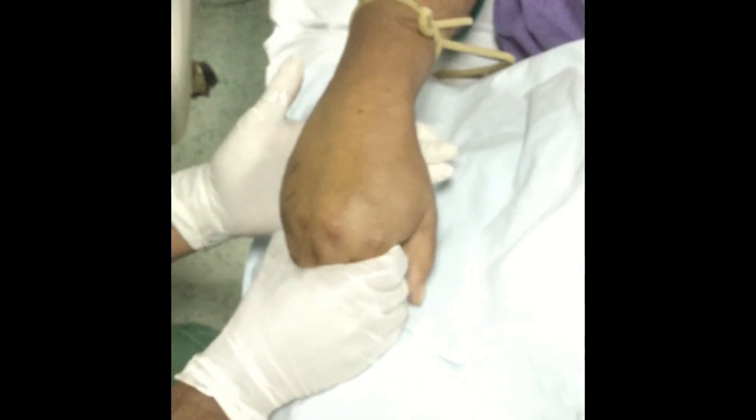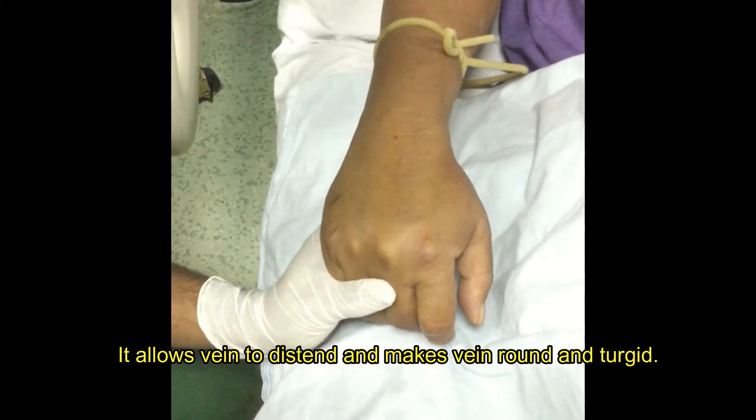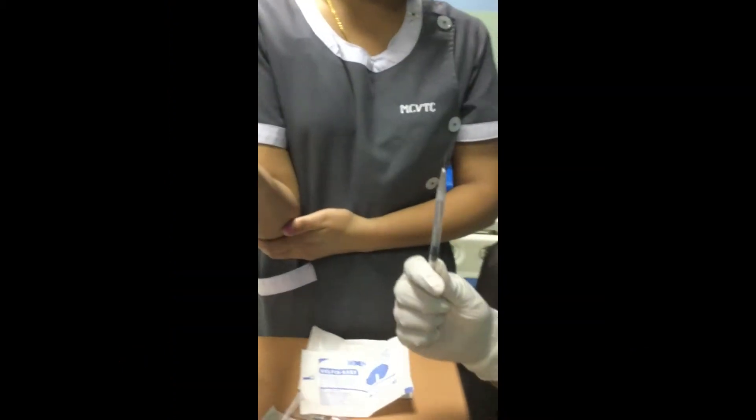Ask the patient to make a fist and ask them to open and close it several times. If the patient is unable to do so, passively contract and relax the hand below the cannulation site.